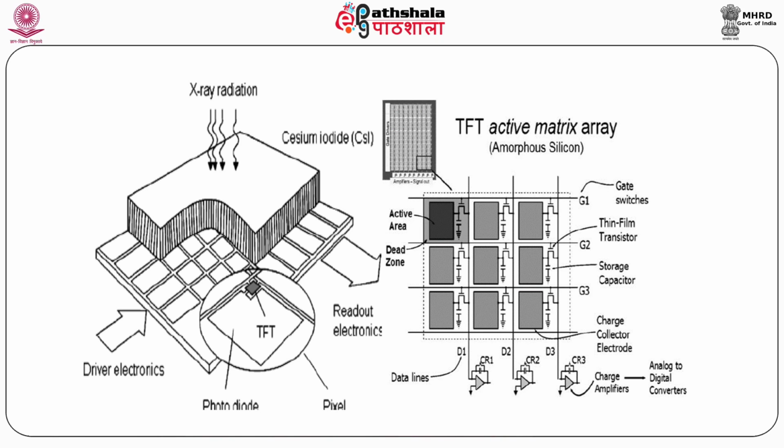We need to have some separate digital detectors for taking, for example, a chest X-ray. You need another receptor that should be on a vertical stand, so in digital radiography two digital detectors are used.